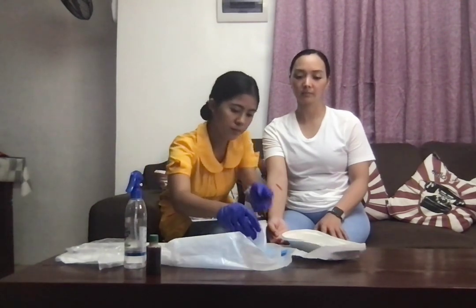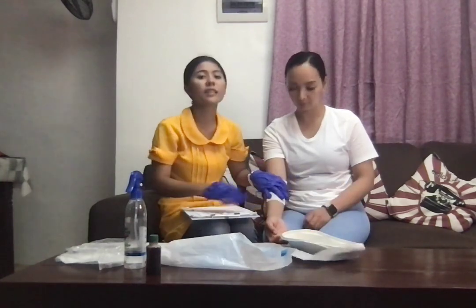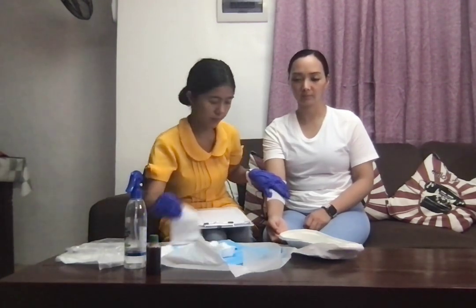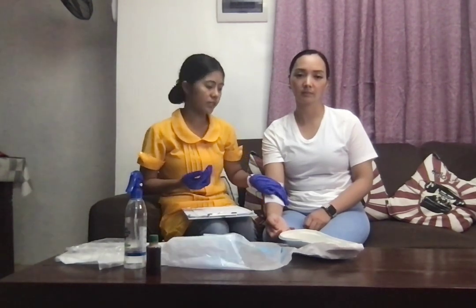After that, I'm going to apply a layer of dry sterile dressing over the wound. Forceps may be used to apply the dressing. After applying the first layer, I'm going to place a second layer of gauze over the wound site. I'm going to adjust the gauze depending on the wound drainage. I'm going to apply now the elastic bandage or surgical or abdominal pad over the gauze at the site as the outermost layer of the dressing, and I'm going to secure it with tape.